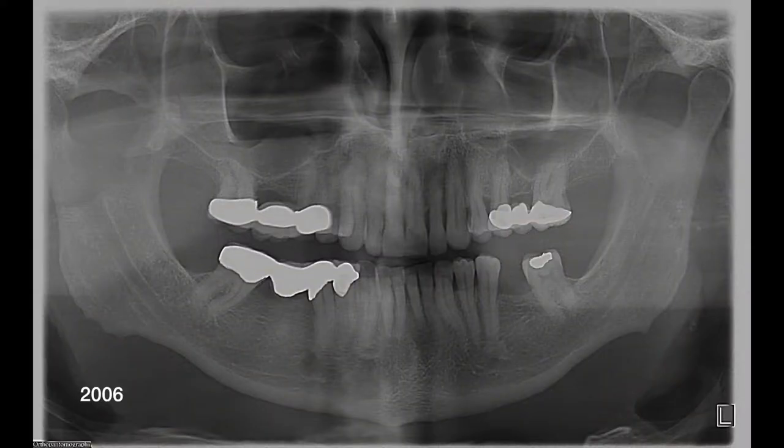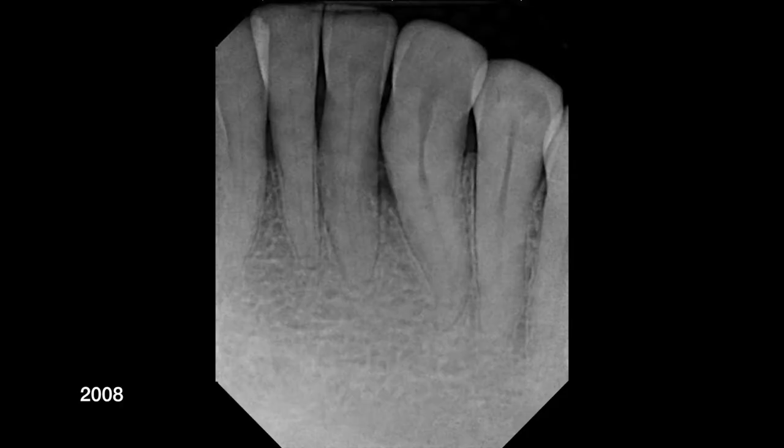Let's go back and take a look at this individual in 2006 when he first came to our office. Back then things looked pretty decent. He's got three bridges in different quadrants, he's missing a tooth on the bottom left, and the lower front segment looks pretty decent. If we look two years later in 2008, I just found an anterior PA in his chart, and maybe there's a small hint of some bone loss, but I don't think any of us would be overly concerned about that small dip at that point.